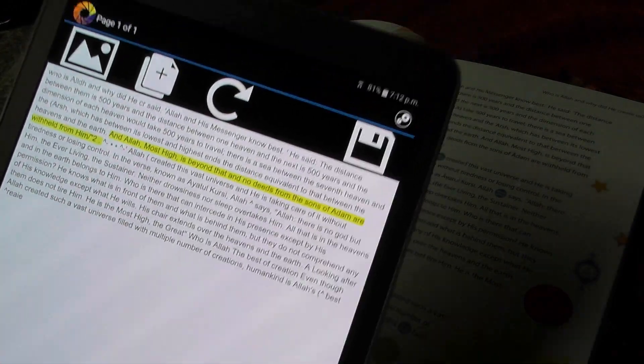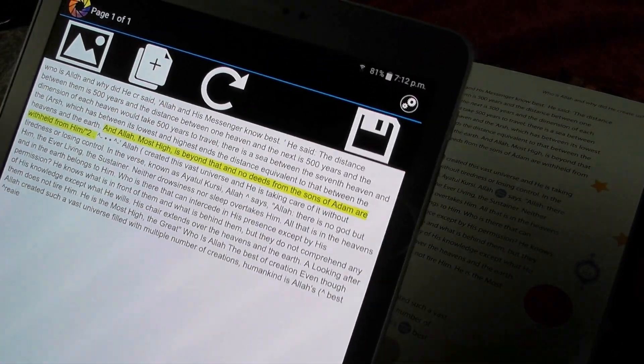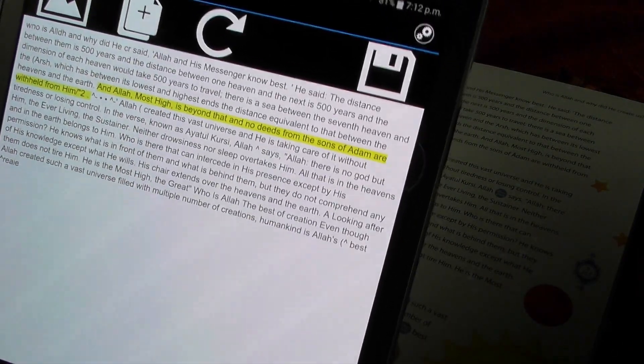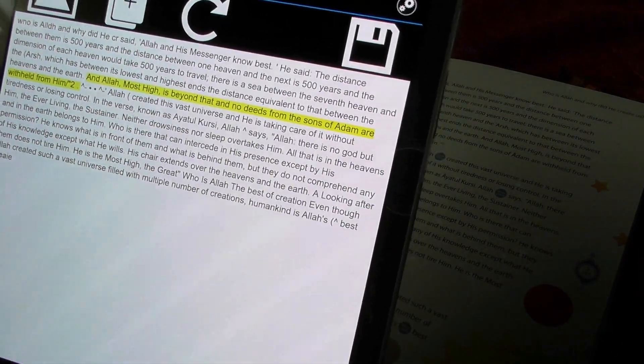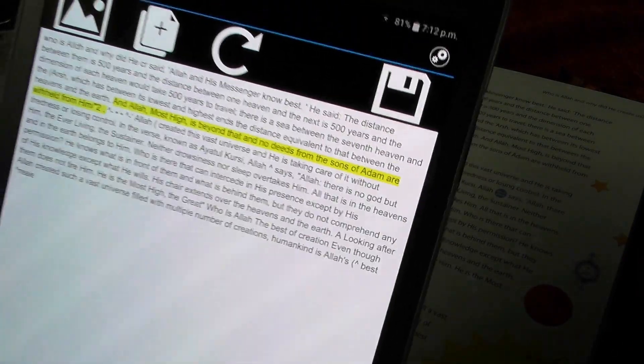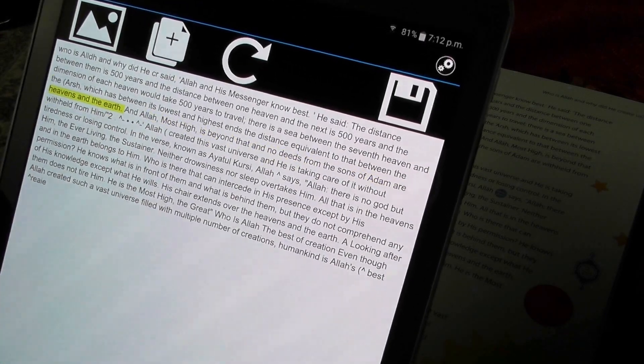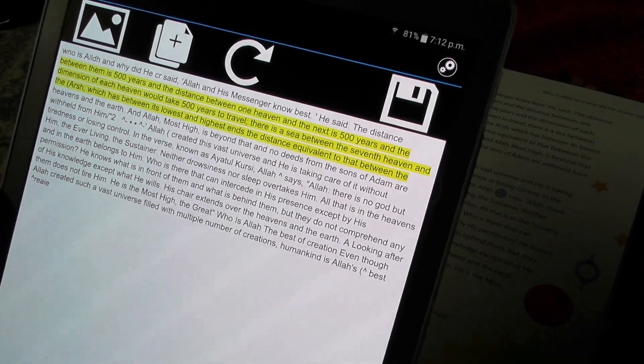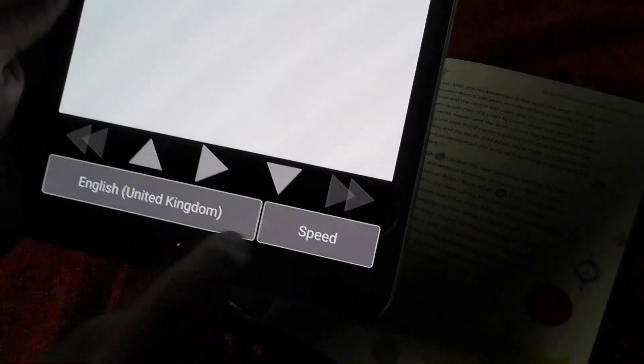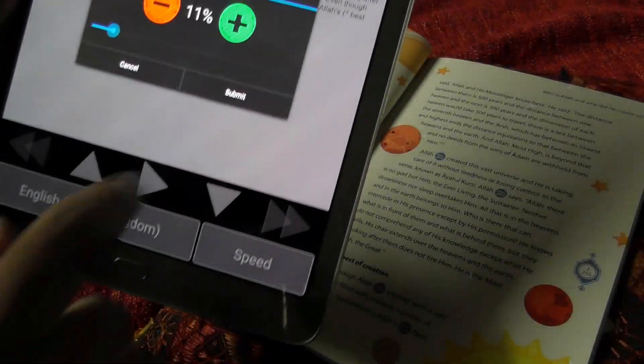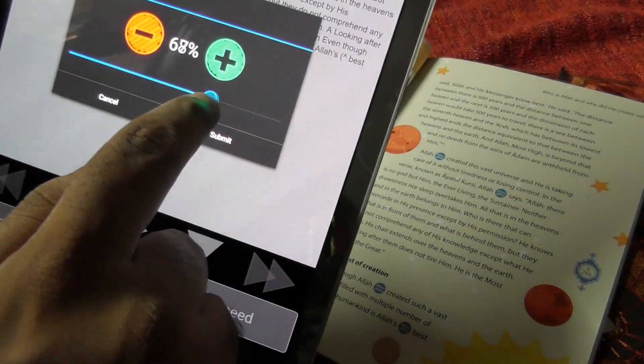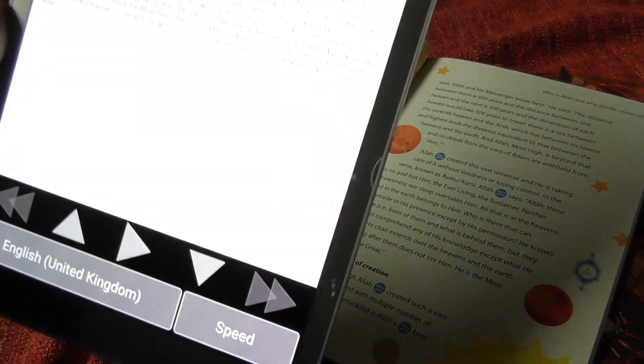And Allah, most high, is beyond that. And if you want it can go slower. If you want to change the speed, you can change it to some really fast. It will go faster. Let's try that.